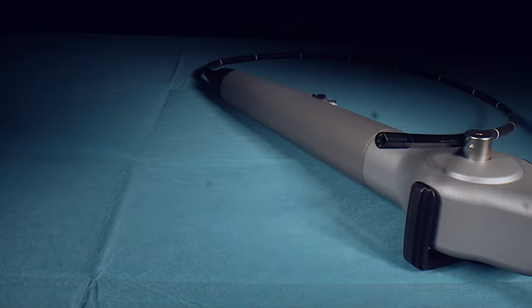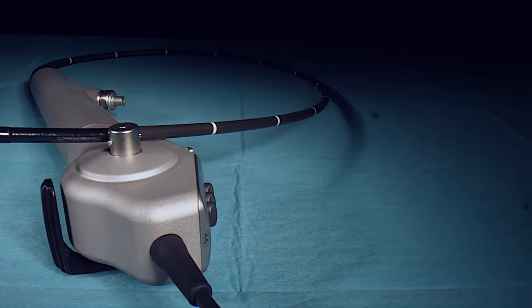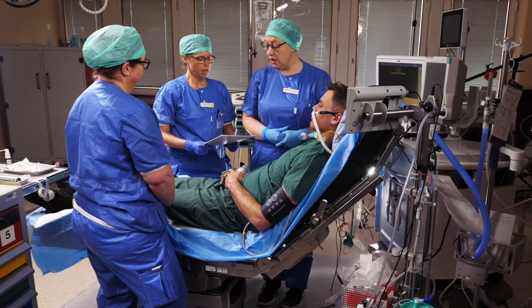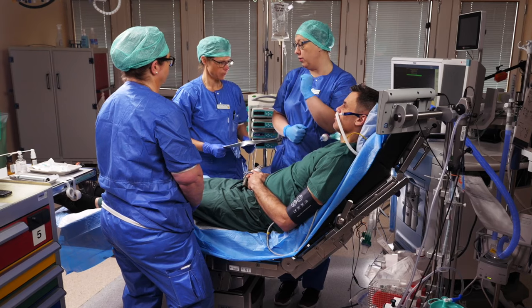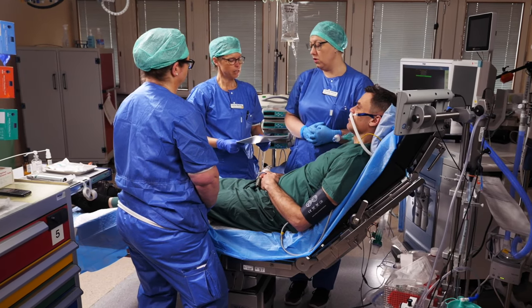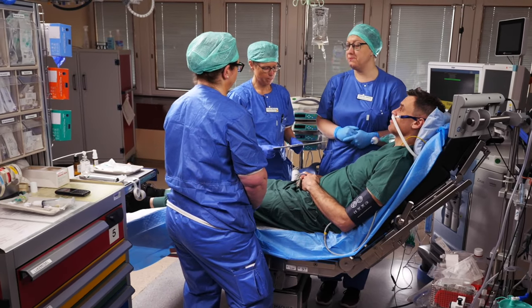We use a modern video bronchoscope, which is a great tool that allows for situational awareness amongst all team members and good teaching conditions. Your team should consist of trained staff with individual roles assigned, communicated and confirmed. There should be a second operator well trained in airway management, usually an anaesthetist or an ENT surgeon, and at least one assistant.